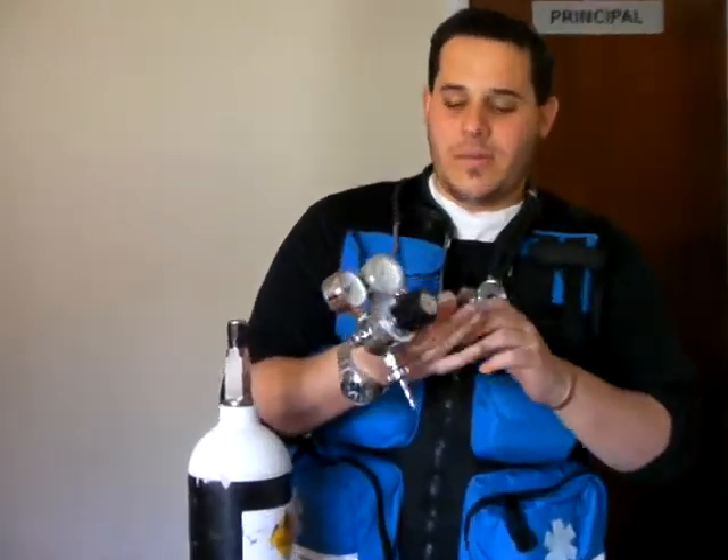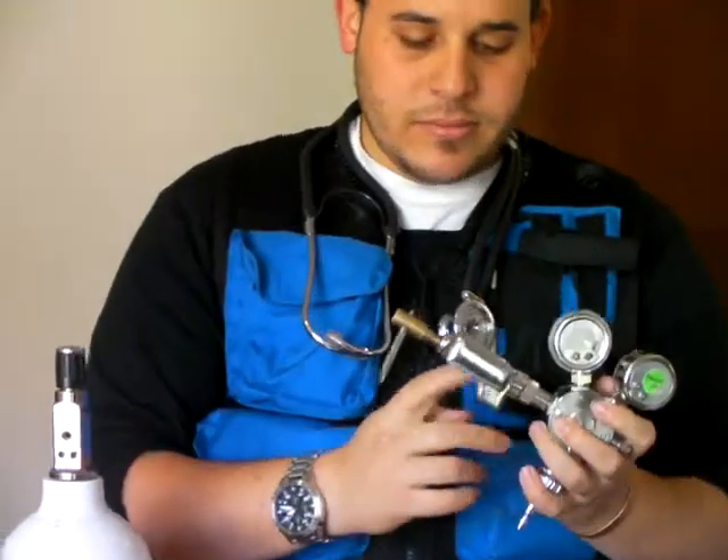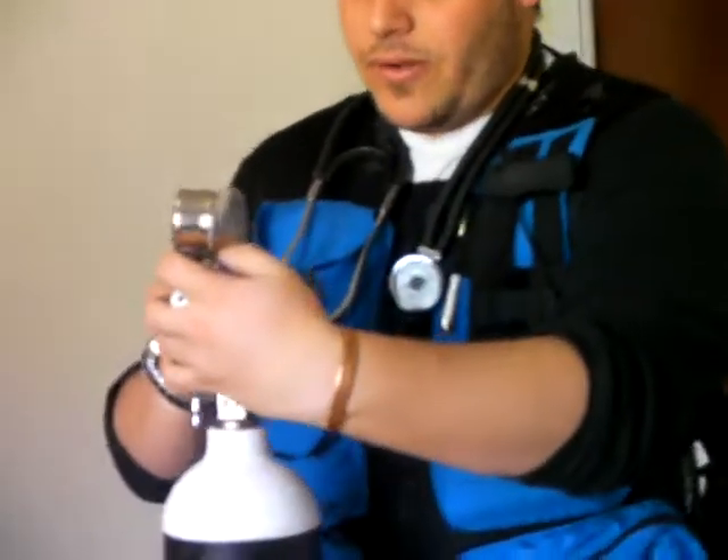Make sure you have the right regulator. You've got two holes corresponding to the two holes over here. Check for the Bodok seal, and then apply the regulator correctly.